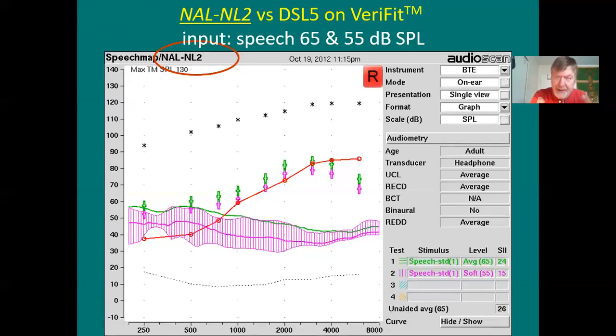And now hearing aids and hearing loss are talking in the same language. And you're no longer sitting there saying insertion gain at the bottom, and did my insertion gain hit my target? Now you can literally see with your own eyes unaided versus aided speech, and you can literally map soft, average, and loud inputs, so you can see the outputs plainly laying in the listener's dynamic range.